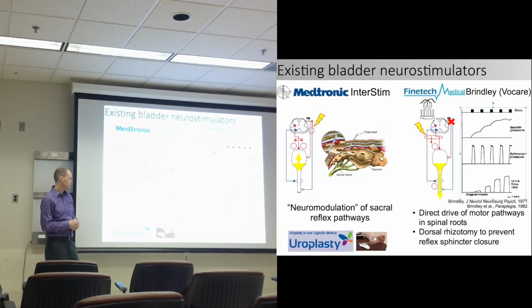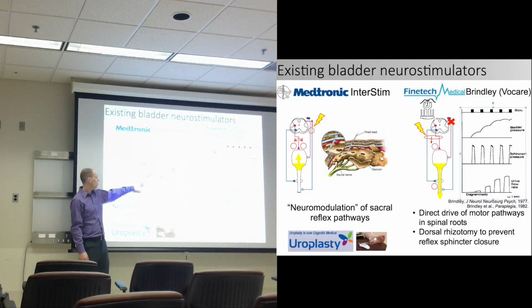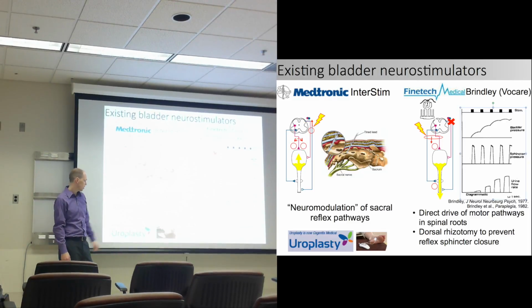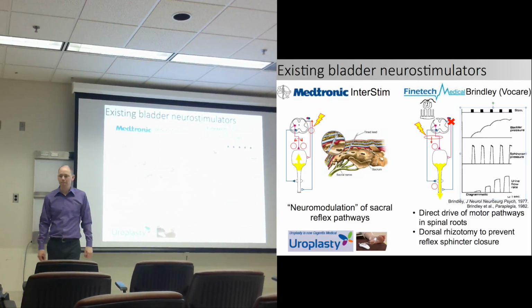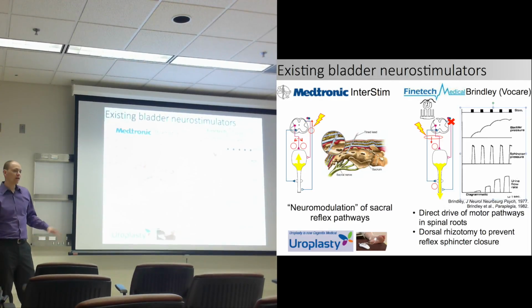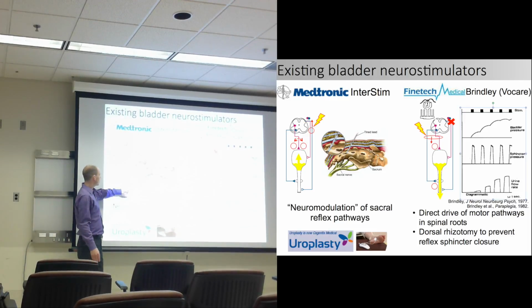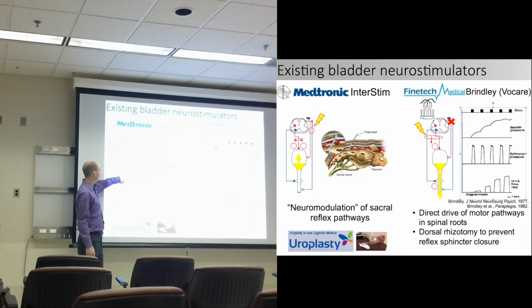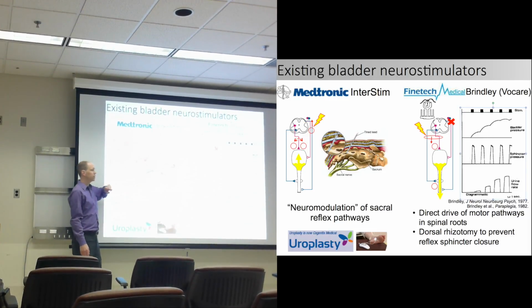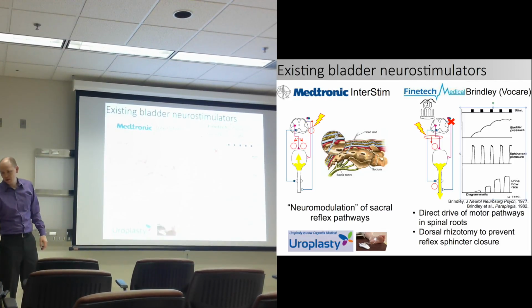Mechanisms of this are not well understood, although the tibial nerve does have some of the same spinal roots as some of our sacral nerve stimulation. Beyond that, it's still very different. So there's a consistency there, and it's a growing area of research in which researchers are looking to get more specific stimulation of some of these tibial nerve pathways that feed into the sacral nerve and the muscular targets, perhaps with a more selective stimulation approach.